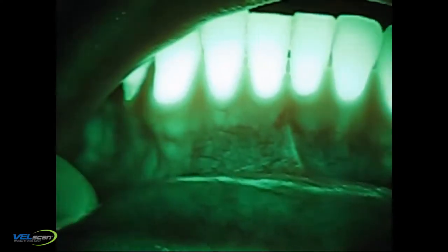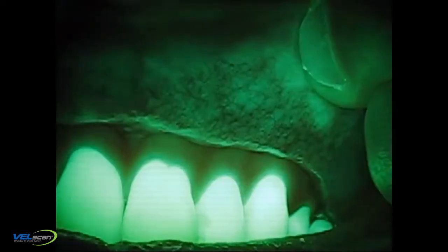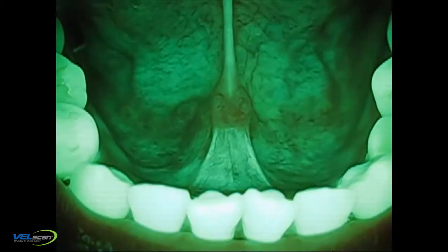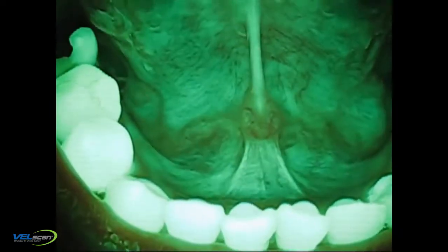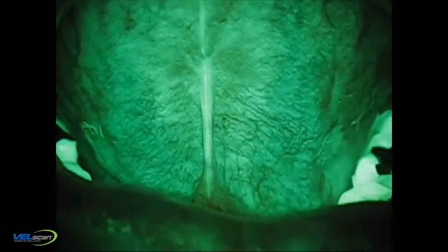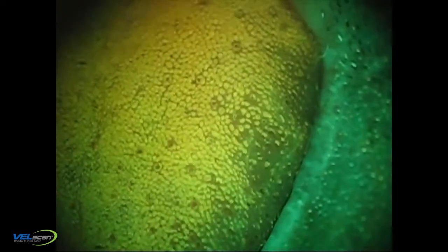There is no clinical fluorescence presentation through the VELscope VX that is definitely positive for dysplasia, oral cancer, inflammatory oral changes, or any other type of oral disease. It's important to understand that the VELscope VX is not a diagnostic test with a positive, negative, or yes-no answer. Similarly, the conventional intraoral exam does not yield a definitive diagnosis from only the visual appearance under white light.